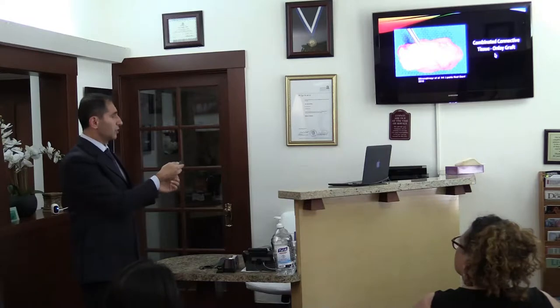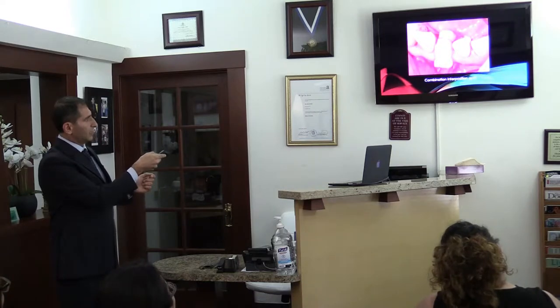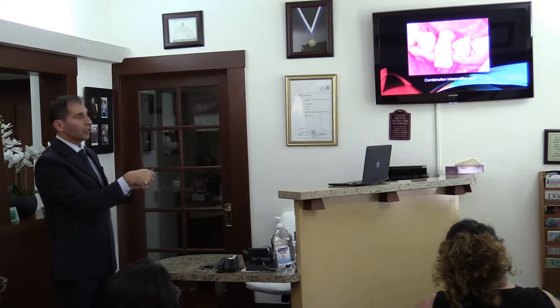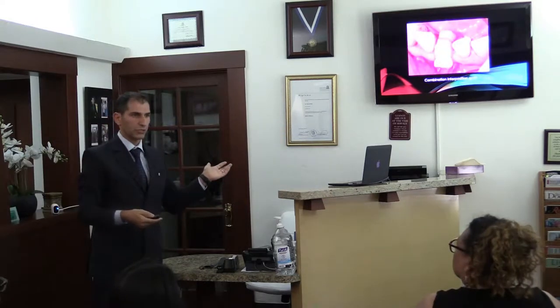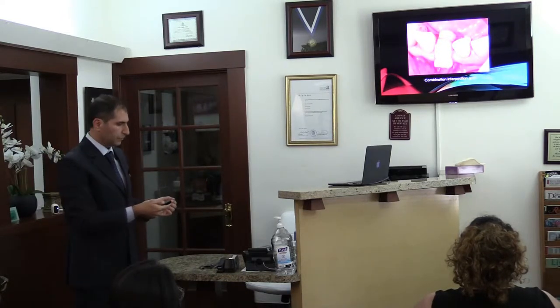So I started using this protocol. This is one of my patients. And the inlay part, the interpositional part, I use it for the facial and the lingual. So I'm getting more stability, and I'm also getting more blood supply, right? So there's a great benefit from doing these procedures on your patient for socket seal procedures after immediate extraction of the tooth.